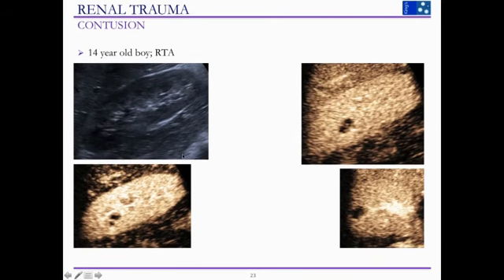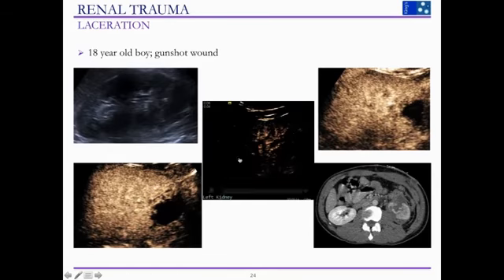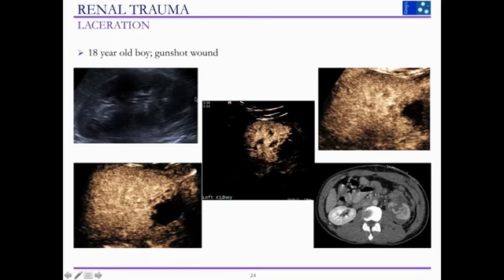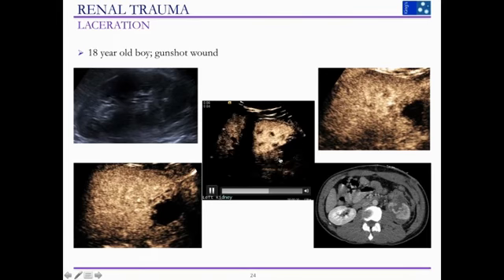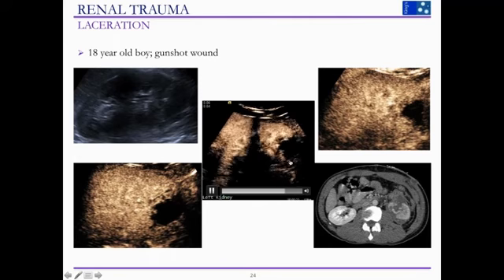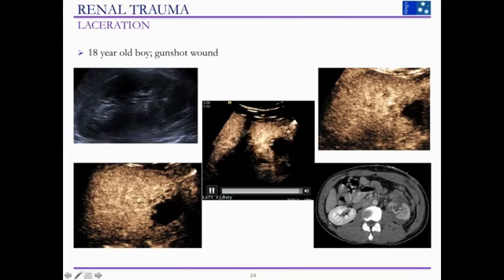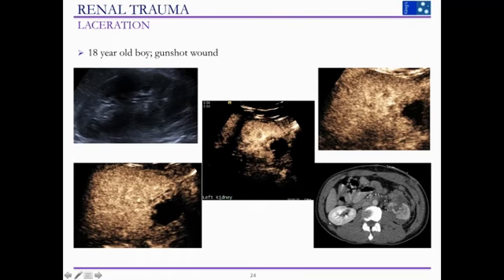Here is an example of a very small contusion following an RTA: it was very difficult to see on the baseline scan, but after contrast you can see this small area of contusion in the renal parenchyma. Another example is a gunshot wound, which wasn't clearly shown on the B-mode scan, but following contrast administration you could delineate the tract going through the mid-lower pole of the kidney — confirmed on the CT scan.